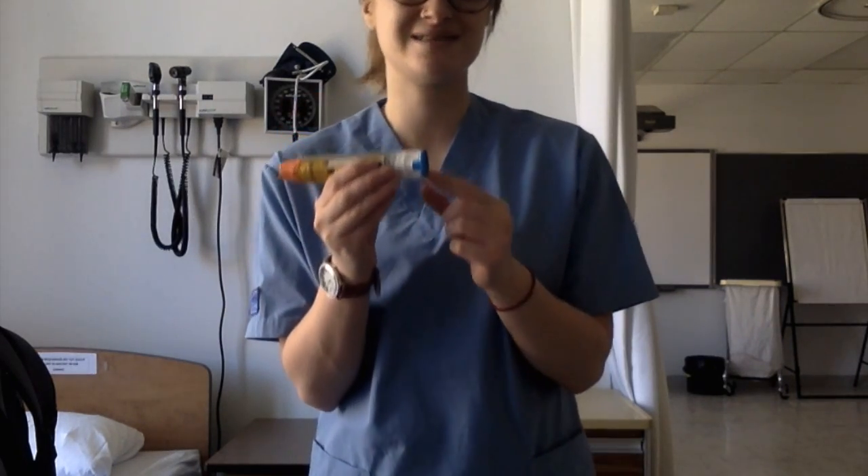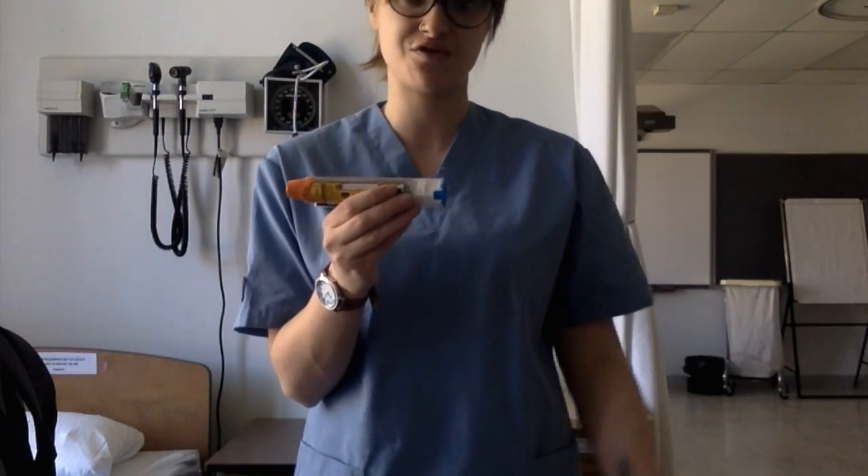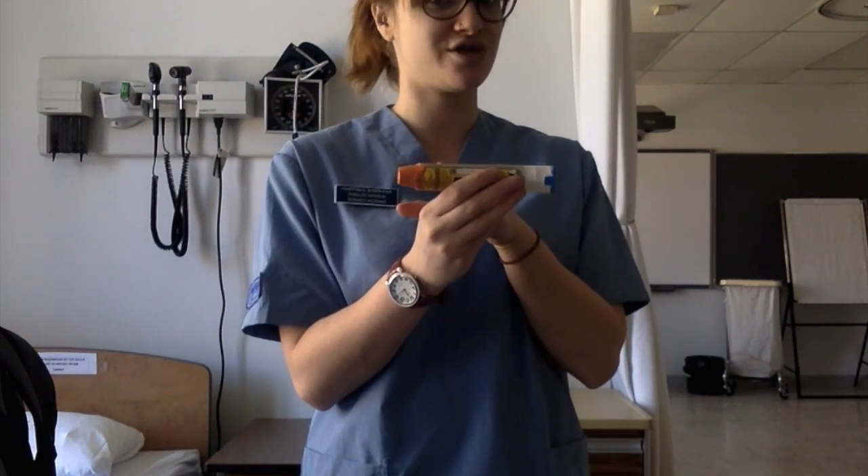The blue tip here is the safety lock. An easy way to remember which side goes into the thigh is: blue to the sky, orange to the thigh.